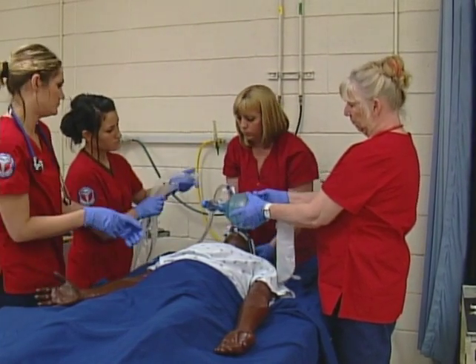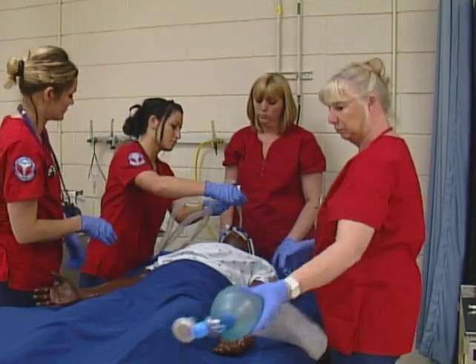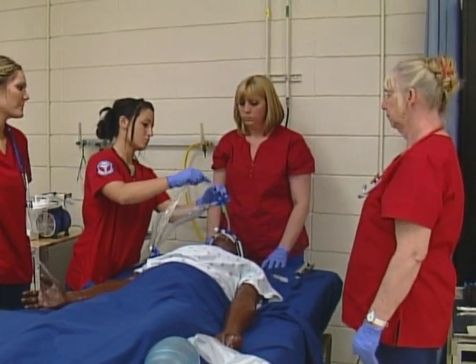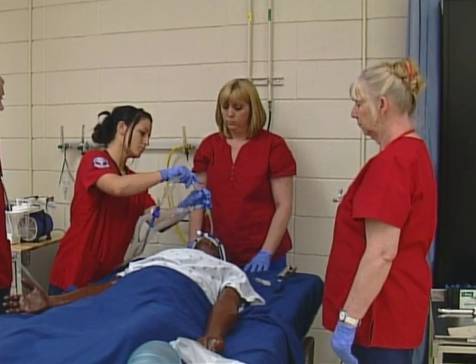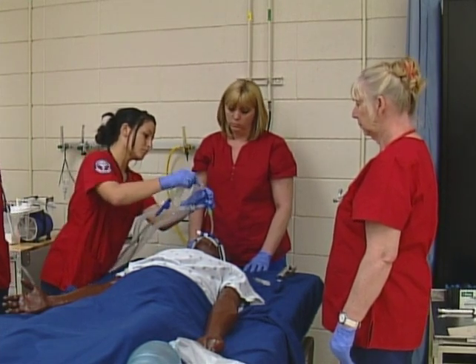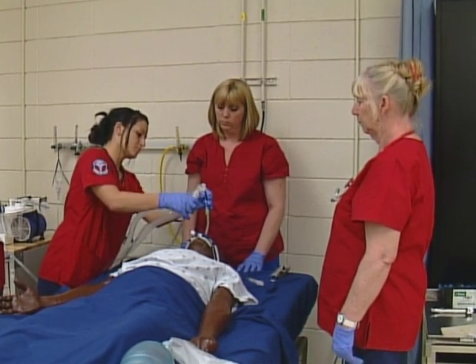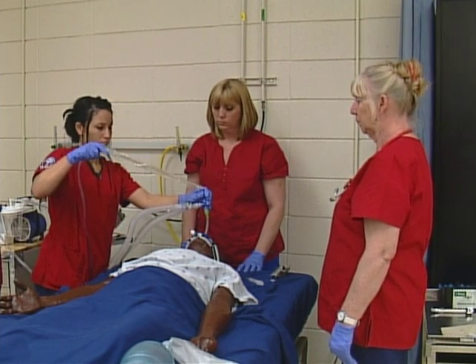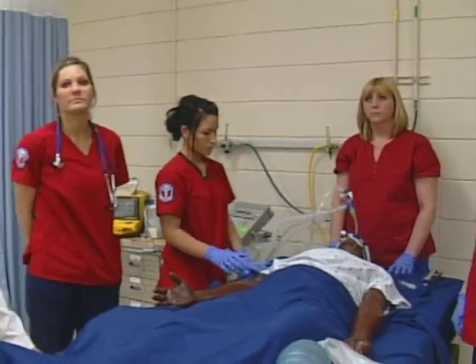Preparing to put the patient on the mechanical ventilation, which will actually be supplying all the patient's ventilatory needs from this point on. You see Carrie's now performing a suction, an inline suction. She's removing any of the substances that may be occluding the airway or providing difficulty for this patient to receive this ventilation. Removing those into the vacuum container, and that's pretty much the intubation process.